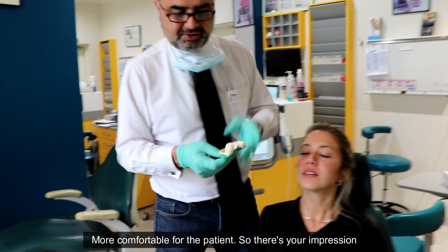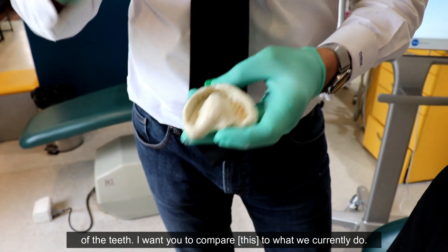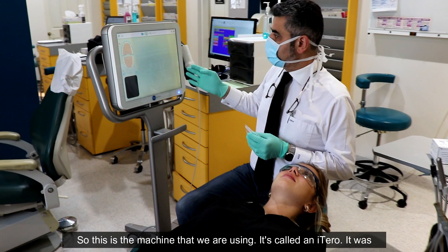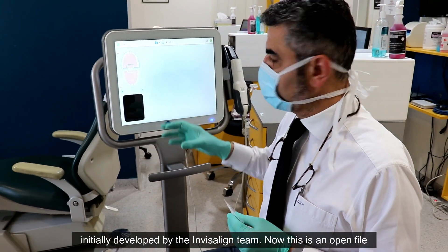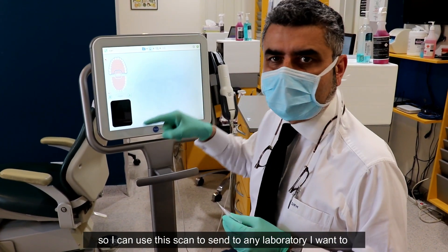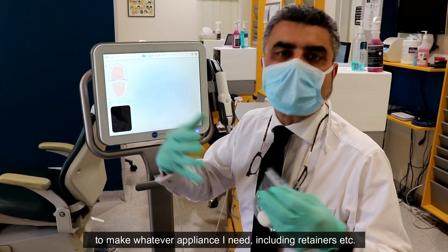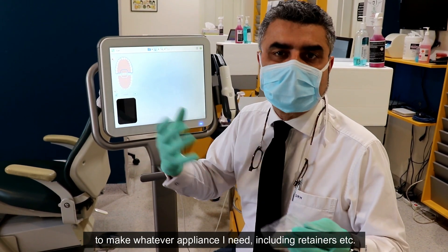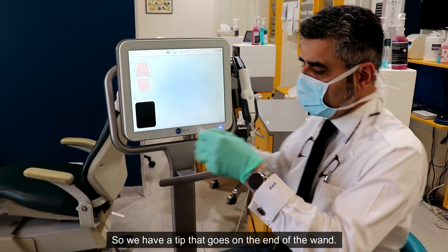So there's your impression of the teeth — I want you to compare what we currently do. This machine that we're using is called an iTero. It was initially developed by the Invisalign team. Now this is an open file, so I can use this scan to send to any laboratory I want to make whatever appliance I need, including retainers.